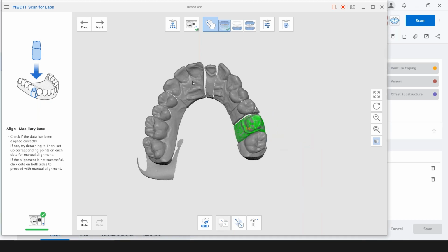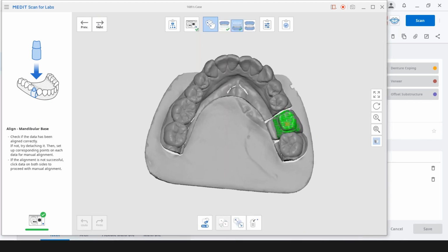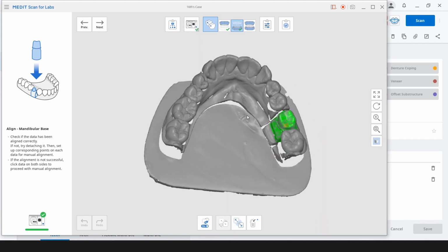All right, and then we're gonna go next. This AI lines it up again nicely. Okay, so it looks good. Got the number 30 there. If you need to turn it off, use this here.